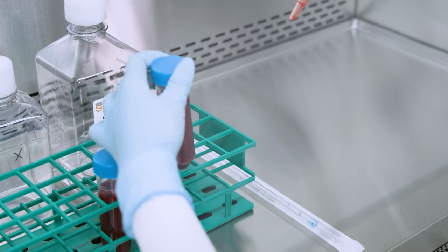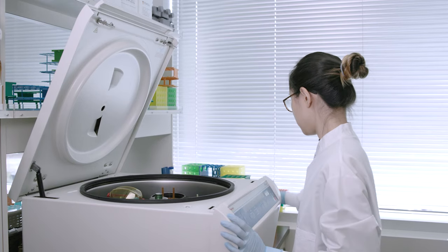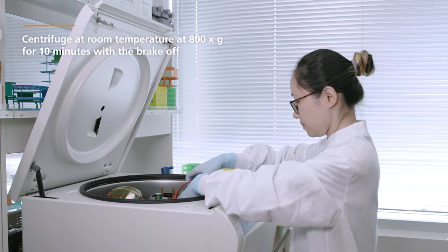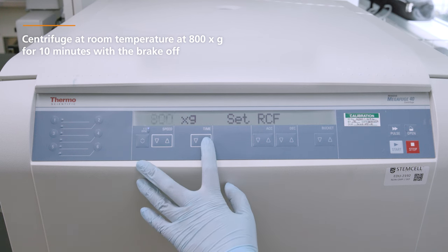Tighten the tube's cap and be sure to properly dispose of the pipette. Next, centrifuge the sample at room temperature at 800 times G for 10 minutes with the brake off.